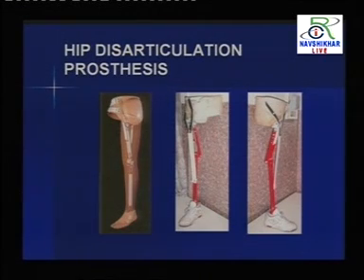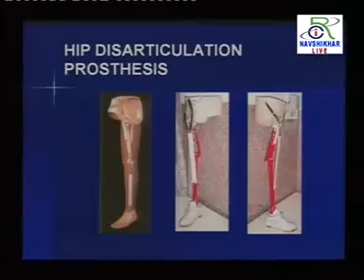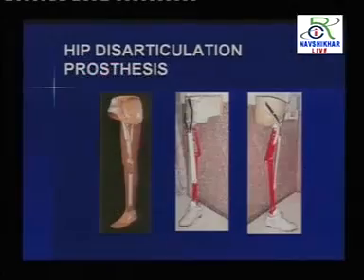Ligaments and muscles give the power that actually works for us. The anterior elastic is working as the quadriceps muscles, the knee muscles, to stabilize the knee. The posterior elastic will work as hip extensors. So these are compensating the lost part of the body by means of functional action. So these are the modular components, compared with our own indigenous design also.